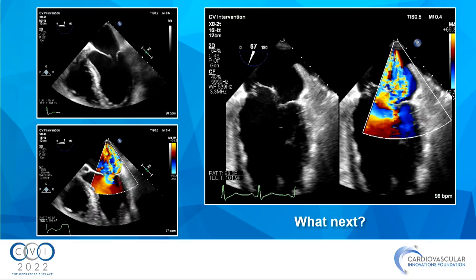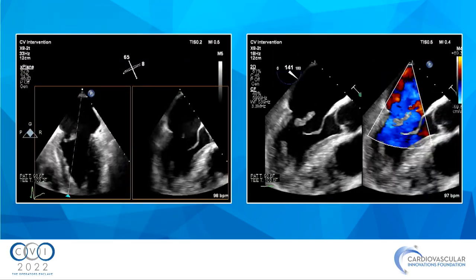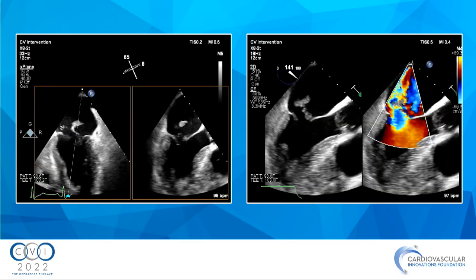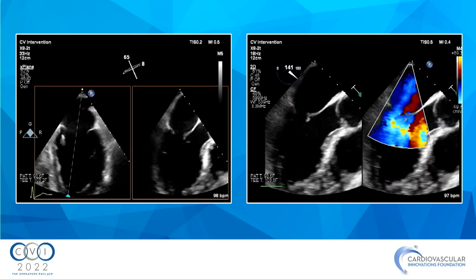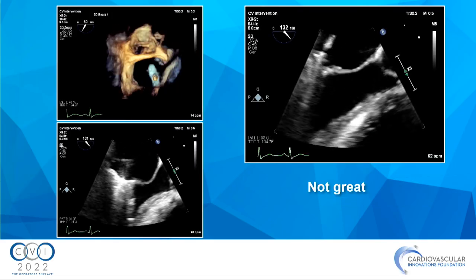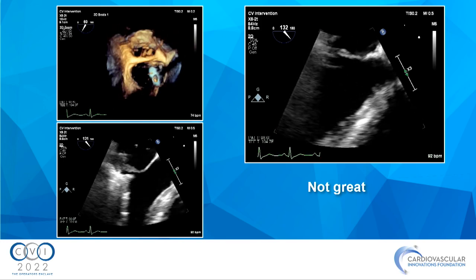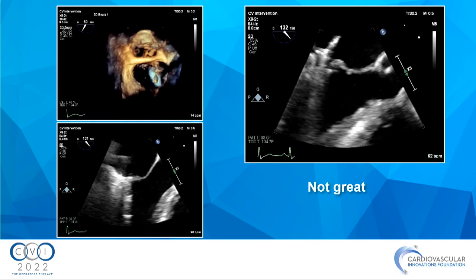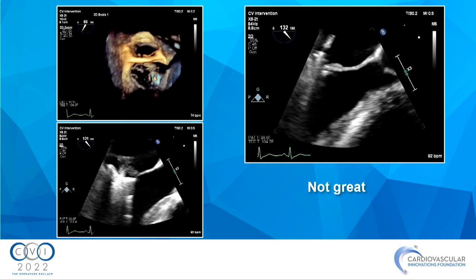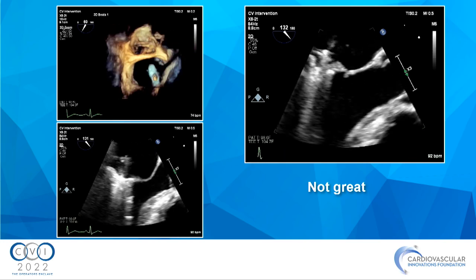Show us what you did. Yeah? Okay. Well, that was easy. So it was a huge pap muscle, and the MR is just torrential. I don't think there was any really serious forward flow here. So we did mitral clip, and you can see there. It was a posterior medial pap muscle rupture, and so we went in, took an XT. It was an XTW, and you can see there it wasn't great. The leaflet insertion just wasn't great.